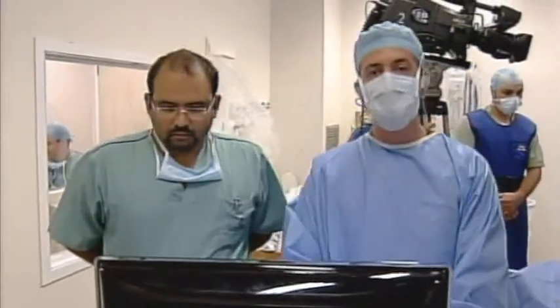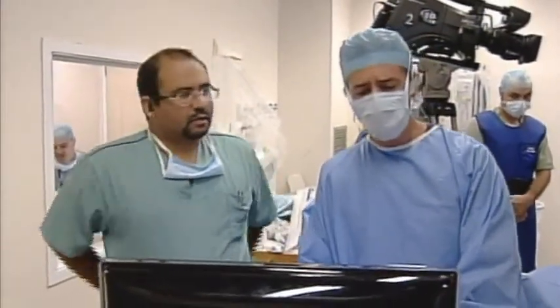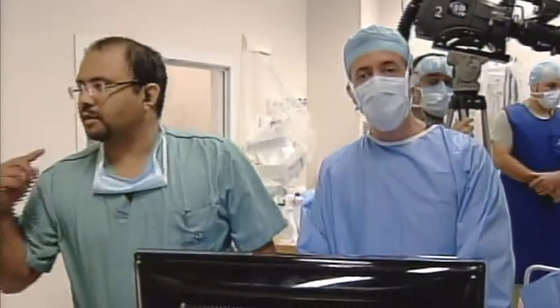So we have one last case to share with you. This is a case that we included in the Absorb trial. As you know, we have three institutions in Brazil randomizing patients.